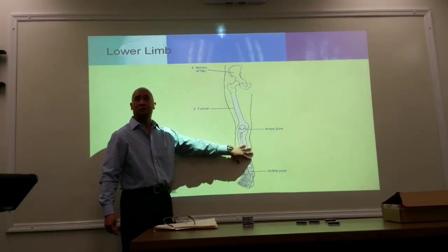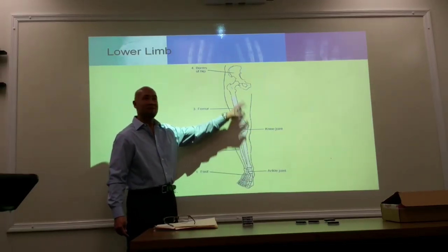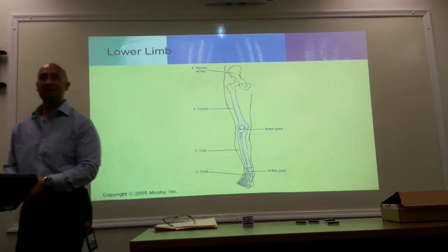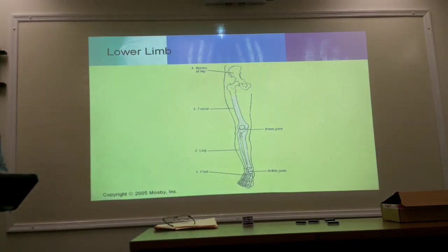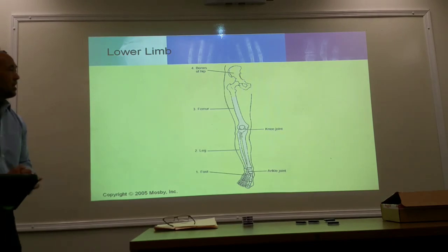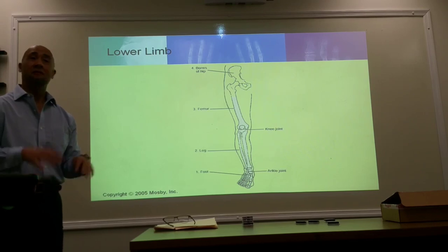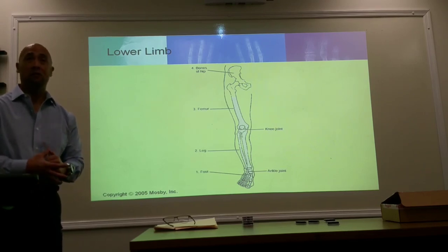Wrist, forearm, elbow, humerus, shoulder. It's essentially the same thing, but we're dealing with lower extremities, and yes, they do have different names, but you will come to find out that a lot of things that we do for the lower extremities are very similar to what we do with the upper extremity.